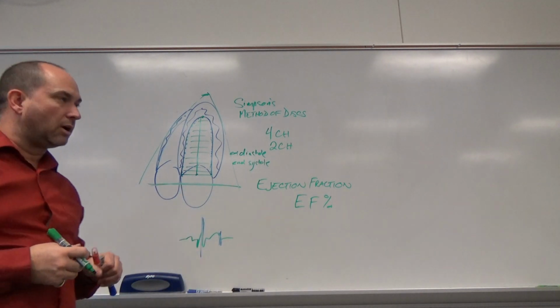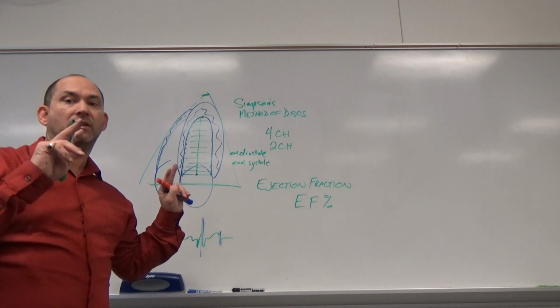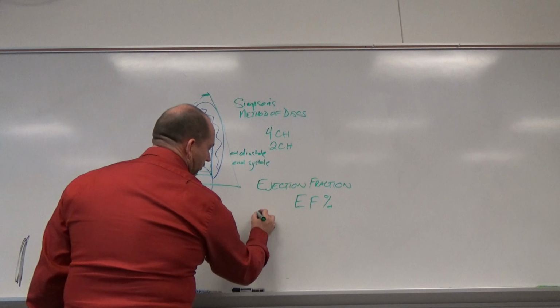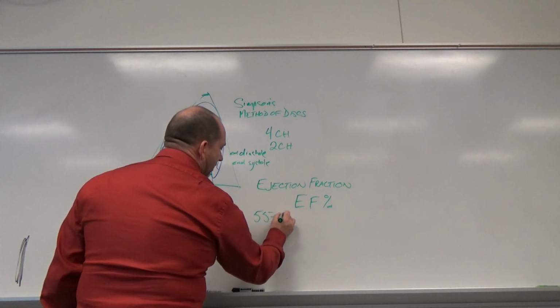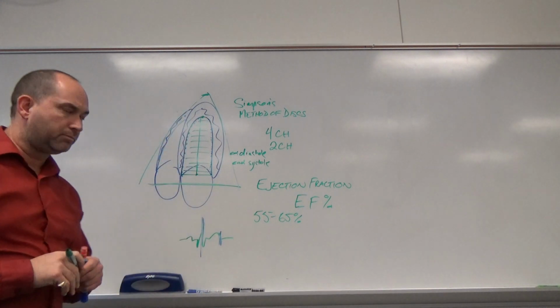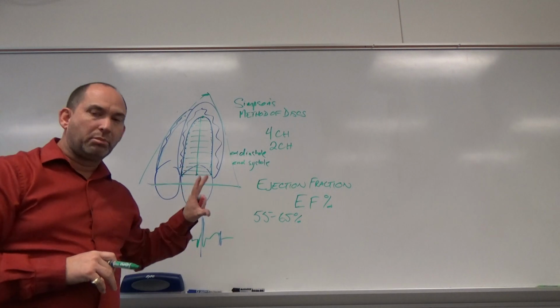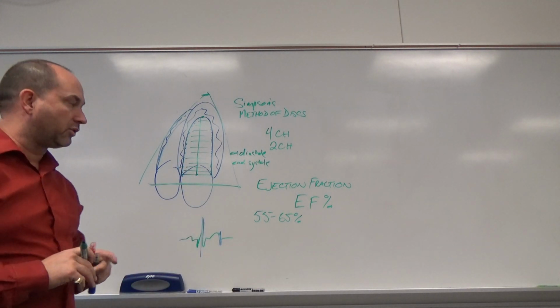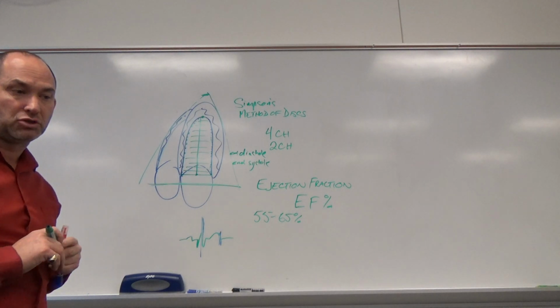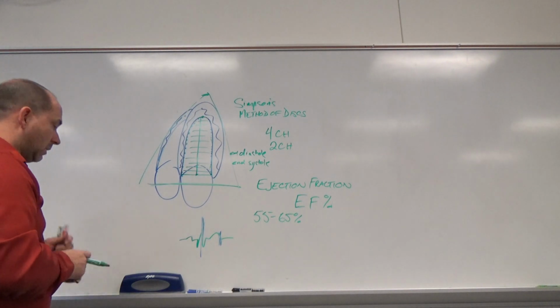Doctors, when they're having a scan in emergency, are honestly most of the time just looking for the EF, the ejection fraction. Normal ejection fraction is between 55 and 65%. Okay? That's also called the biplane method of discs, biplane meaning I need to get it in 4-chamber and in a different chamber, which is usually 2-chamber. So we'll measure in both of those, and do Simpsons.